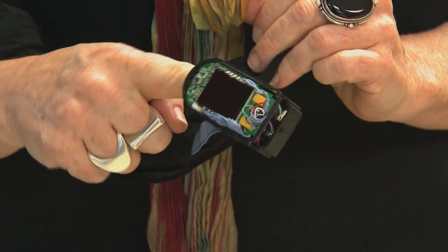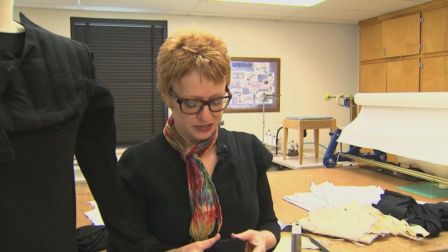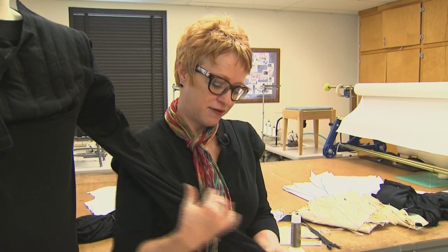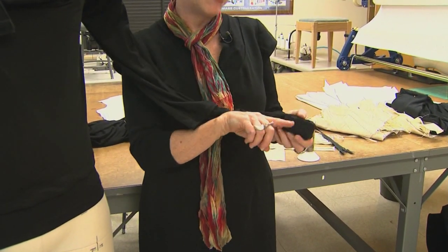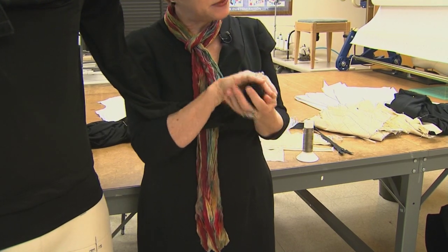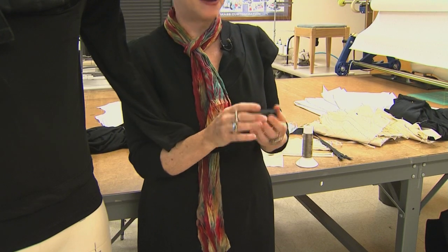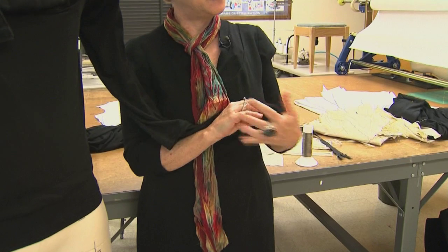The shirt also had to incorporate a fingertip oxygen saturation monitor. Through my collaborators, I understand now that which finger this goes on is very important. When we were deciding on the shape of the part that covers it, if it went over the index finger, it would have one shape. So we were thinking too that if it went on the thumb, that might be a little easier. When you sleep, you might curl up your hand, but no, it needs to go on the index finger. And it just doesn't give us as good of a signal if it goes on a different finger.